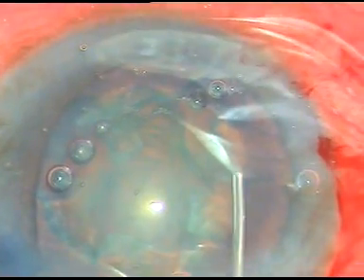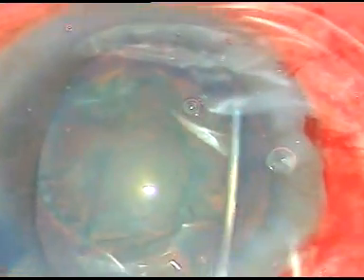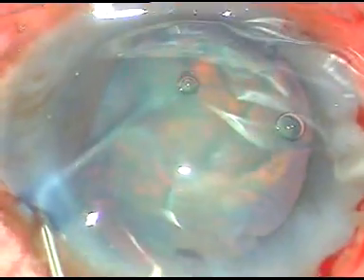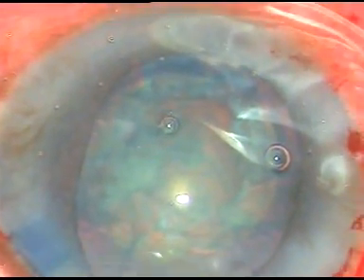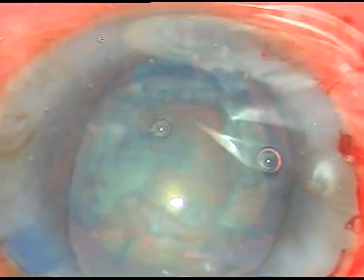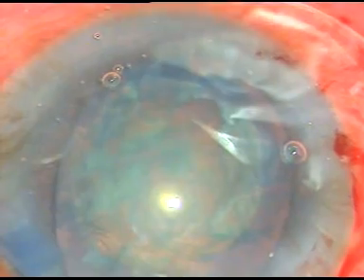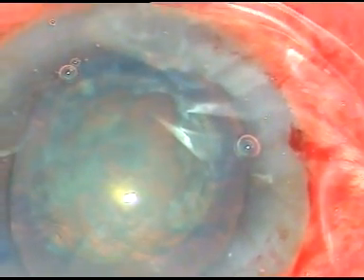Hydrodissection is done again, and this time see what happens. The nucleus rotates freely. Now I inject viscoelastic substance again and again enter into the eye with the Phaco handpiece.